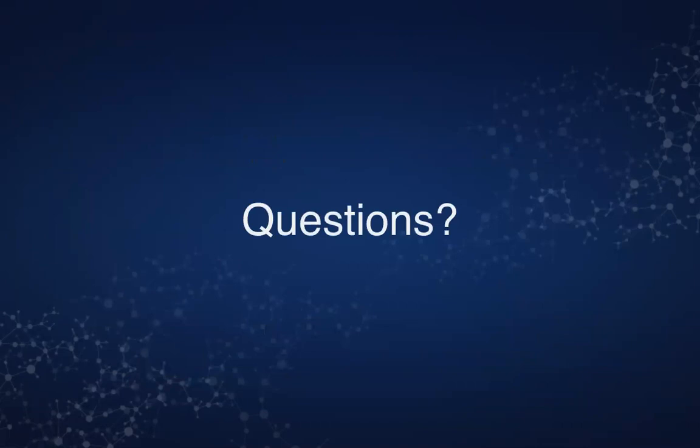Sure. Yeah. So actually, I want to add one more thought about what Mike mentioned and the question about a separate viewer. And there is another question here I see about using DICOM norms to see results embedded in PACS. I think, as Mike mentioned, it's a complicated dilemma. Because on the one hand, you want to create the seamless experience. On the other, if you only use the full PACS integration, you typically have a very limited feature set, probably limited by just showing annotation on images.